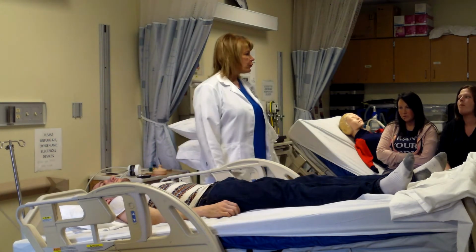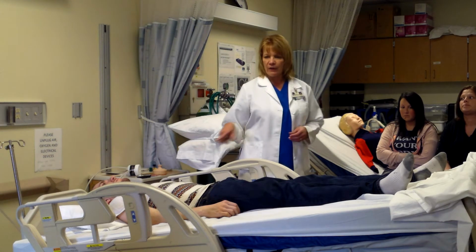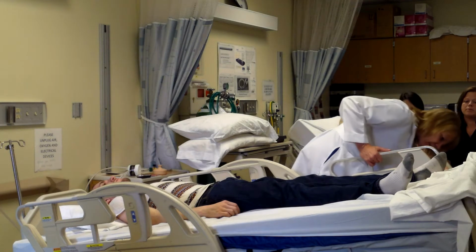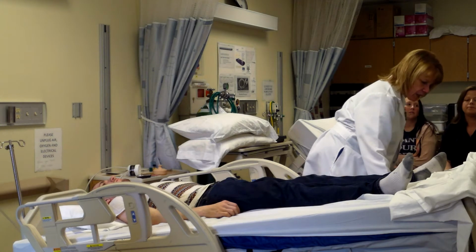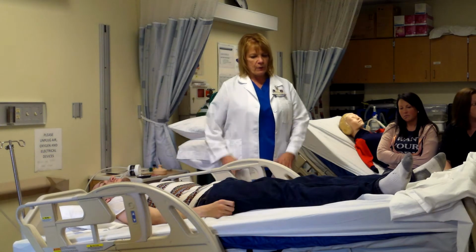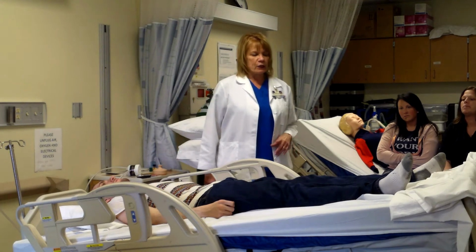So this is what we would call full Trendelenburg. So he's in the Trendelenburg position. Okay. His feet should be approximately 18 to 20 inches above his head. Some of the beds have gauges on them that show you the degrees or the inches, okay? But basically you're going to put the head down as far as it will go. That's going to be your first position for your patient, okay? So the bed is flat with the feet 18 to 20 inches above the head, and the patient is supine. So I need 2 pillows now.